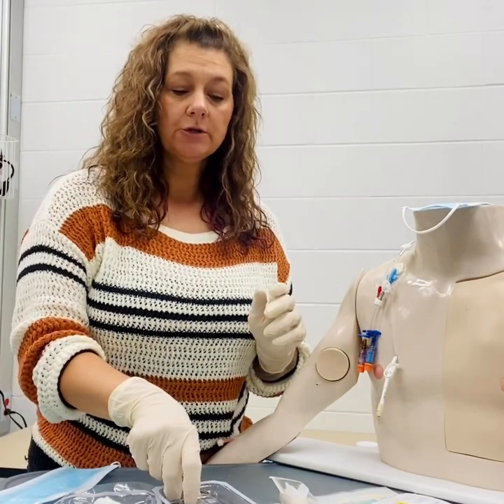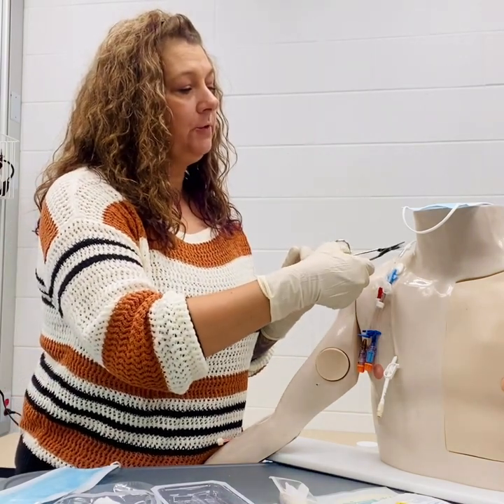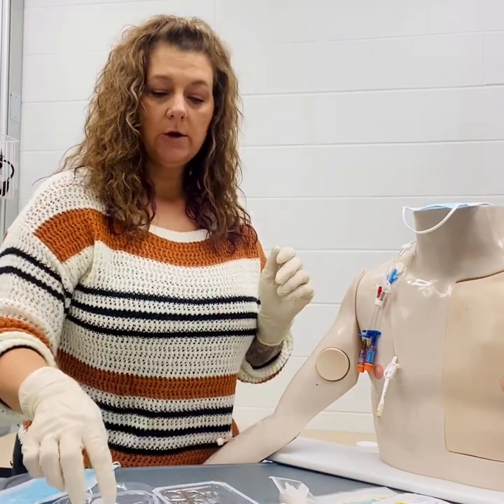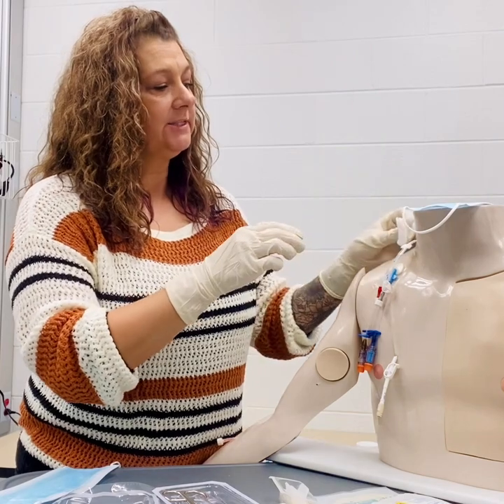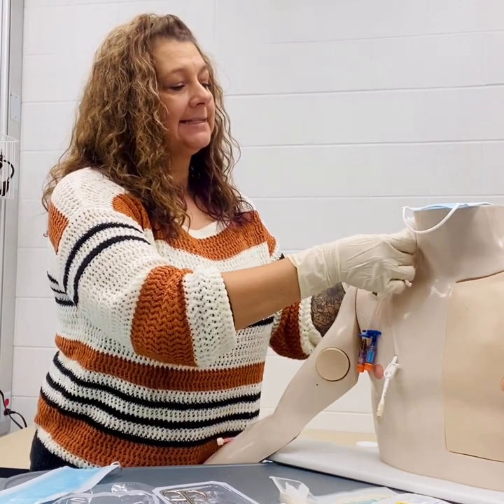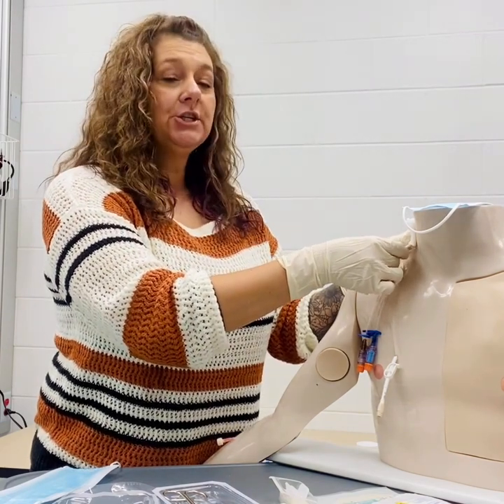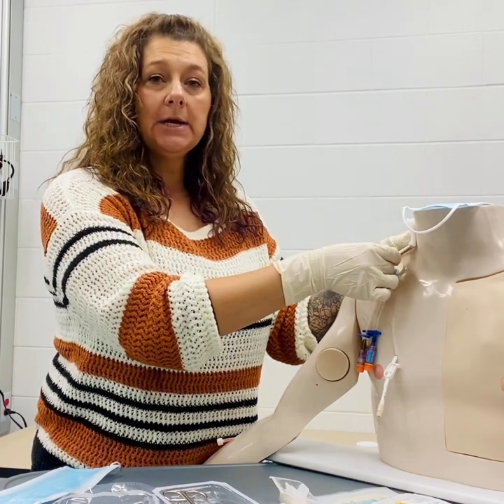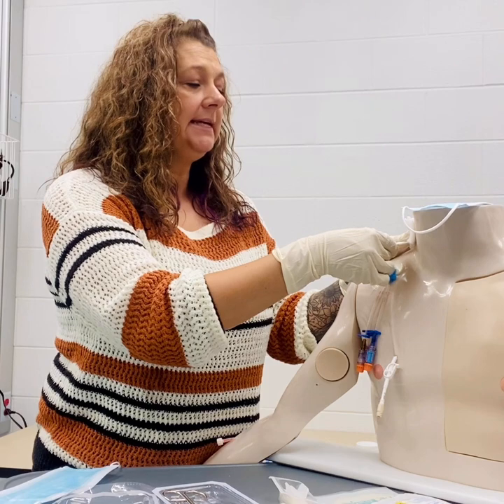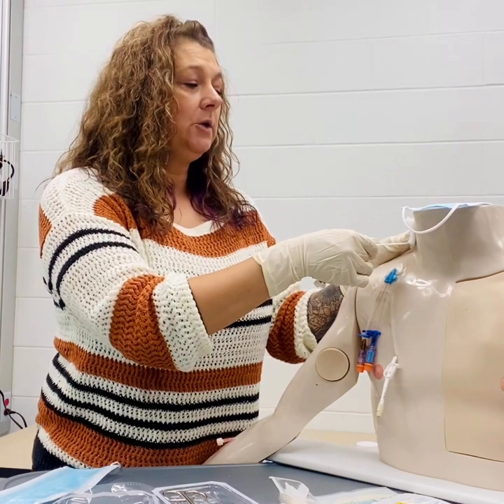Once the site is clean, if there are sutures in place, we would want to take our sterile suture removal scissors and remove those stitches. Then we'll take our sterile gauze and place this over the insertion site with our non-dominant hand. With our dominant hand, we're going to ask the patient to hold their breath and perform the Valsalva maneuver. The patient should be laying supine or at a 10-degree Trendelenburg angle during removal. We'll slowly but continuously pull the catheter out about one inch at a time, ensuring that you have no resistance.